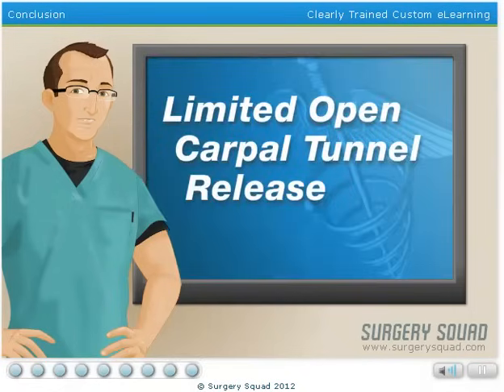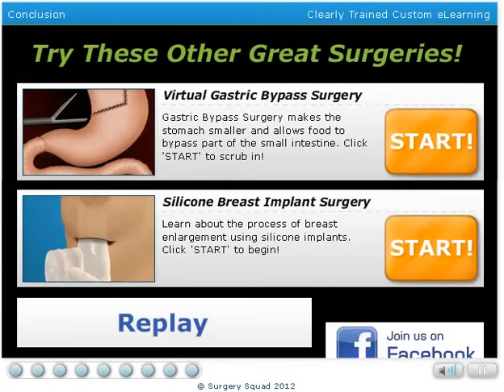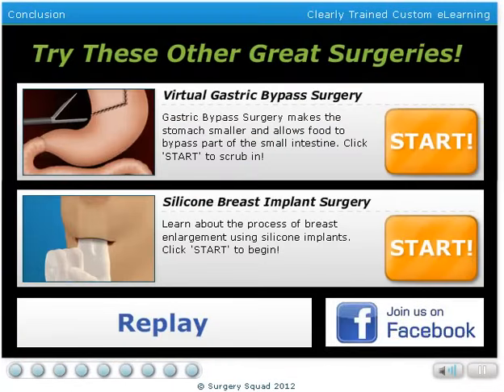And that's a limited open carpal tunnel release surgery. Thanks for stopping by. Why not try out some of the other amazing surgeries here on SurgerySquad.com?